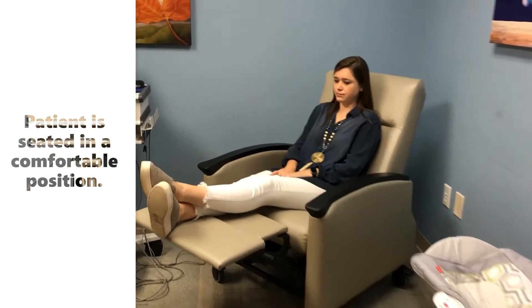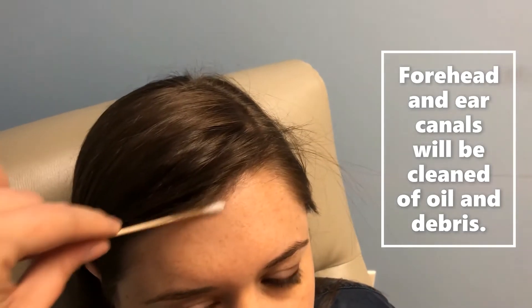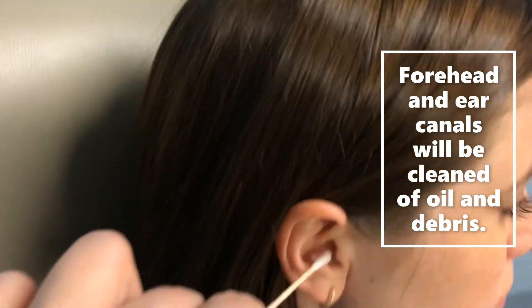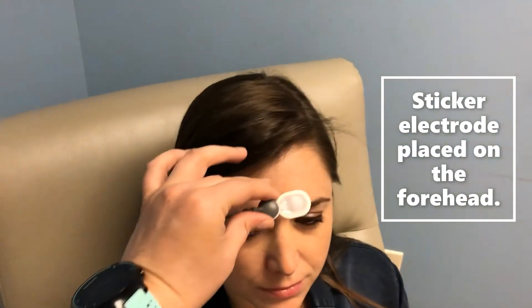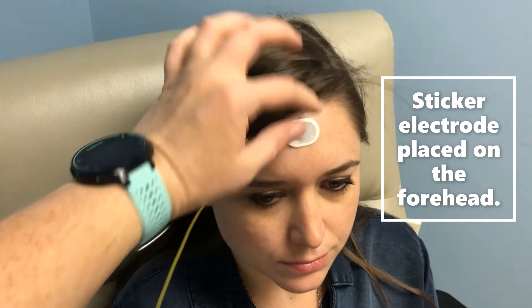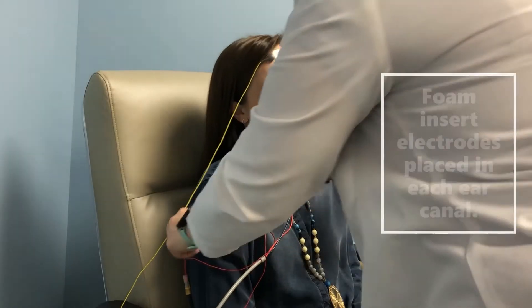While seated comfortably, the patient will be prepped by cleaning the sites for electrode placement. An electrode will be placed on the forehead, and foam electrodes will be placed in each ear.